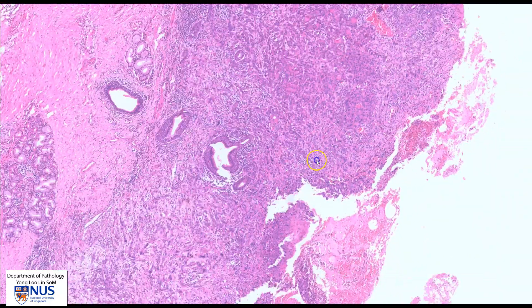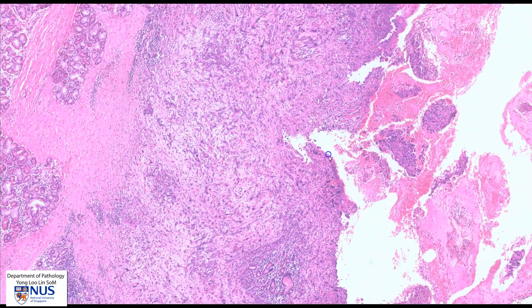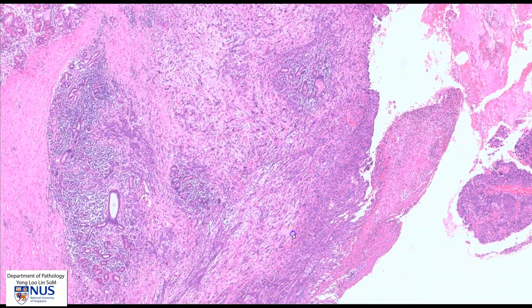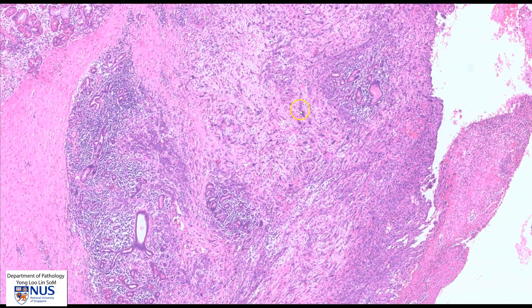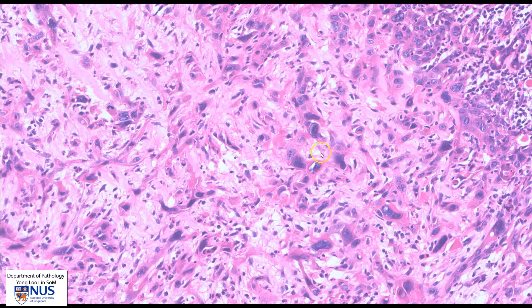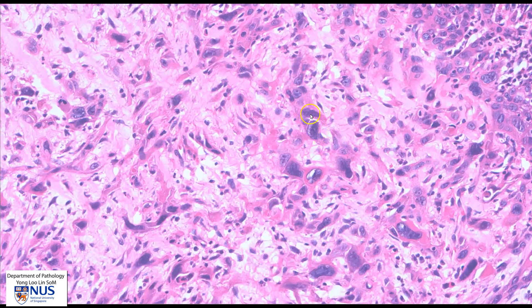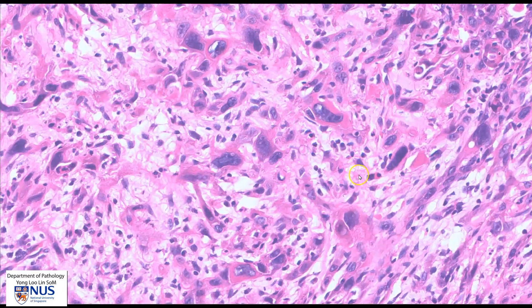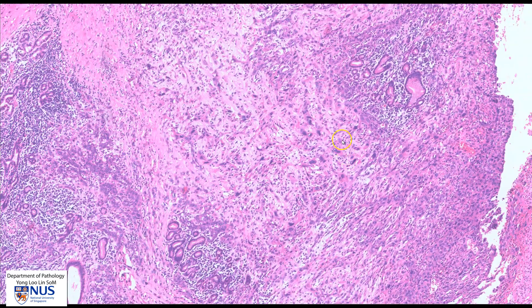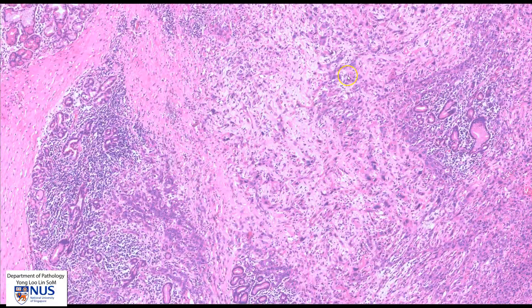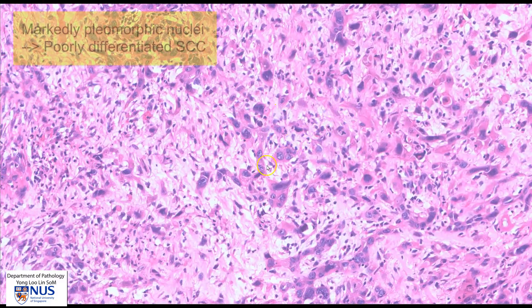Let's move further downwards, and this is coming towards the true vocal cord region. I just want to draw your attention to this area where the cells really appear quite pleomorphic. The nuclei are very large, irregular, and hyperchromatic. In some areas the nuclei are very elongated, so this particular area is markedly pleomorphic.